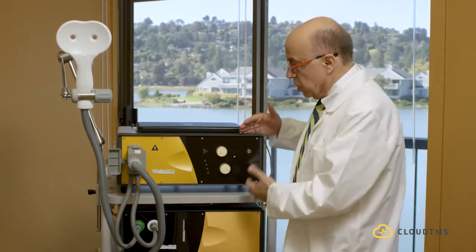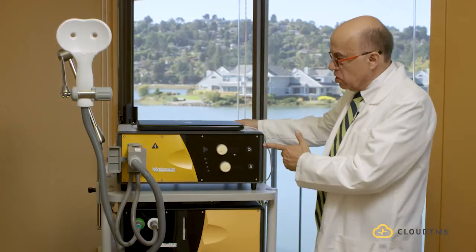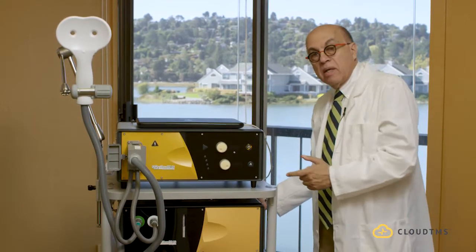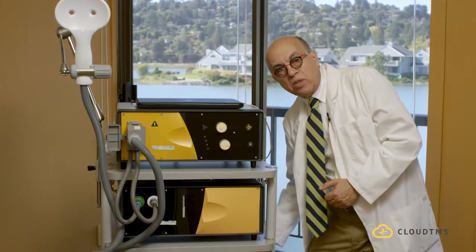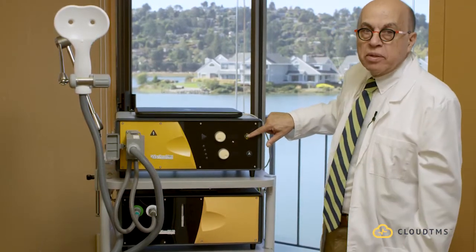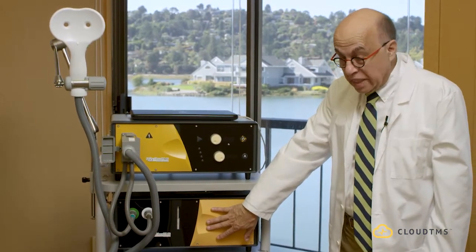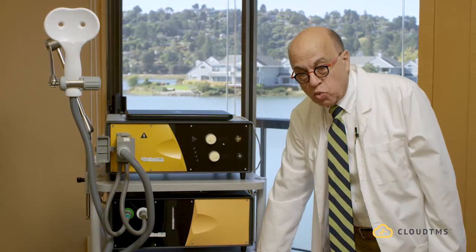This transcranial magnetic stimulation unit with the three modules is turned on from the back. There are three green buttons. I will start by turning the main unit on, then the cooling unit on, and then the additional power supply unit on. Now you can see that as soon as I turn it on, the power button on the main unit turns orange. You don't see anything on the cooling unit yet, but the additional power supply unit turns orange as well.